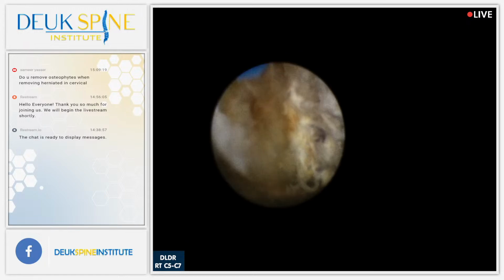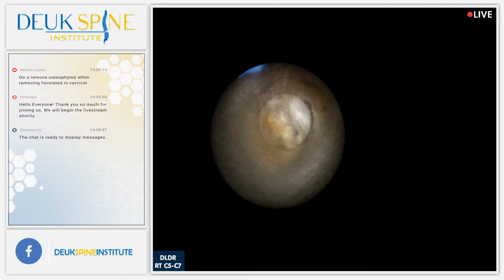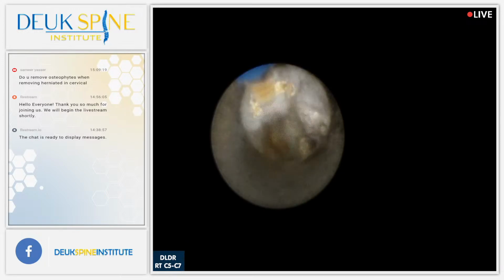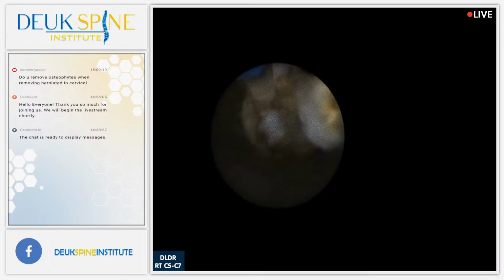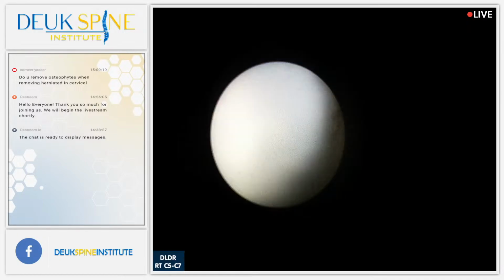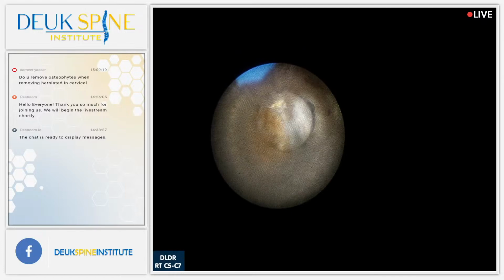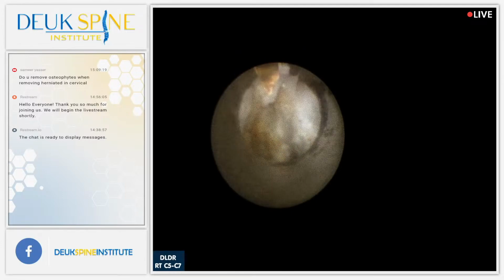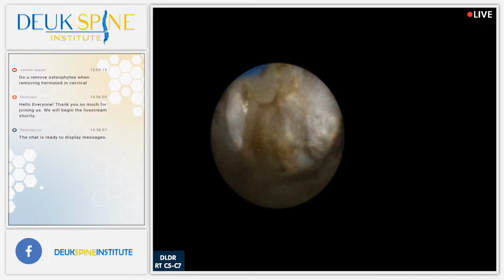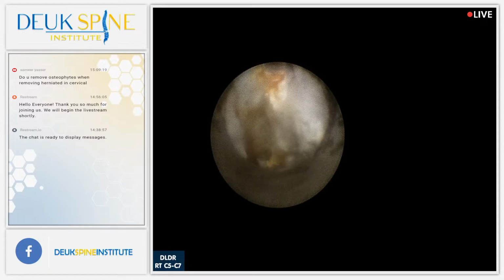I've gotten most of the herniation out. Probably about 80% of it. What's left is some bone spur. There's some more herniation right there, just off to the left side. Again, this has been around for years. I don't know how old his symptoms are, but all of these pieces of herniations are at least 20, 30 years old. So I don't know if he's had these symptoms for that long.